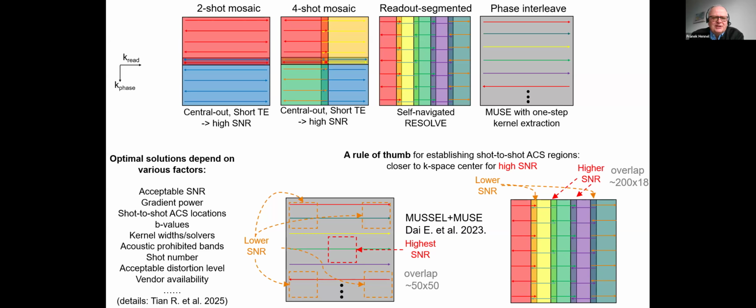But in a mosaic manner, like the first picture on the left, you have the auto-calibration lines measured at very different delays from the excitation. So a little drift of the reference frequency will produce huge changes in phase. Is there no danger that you can misinterpret that?